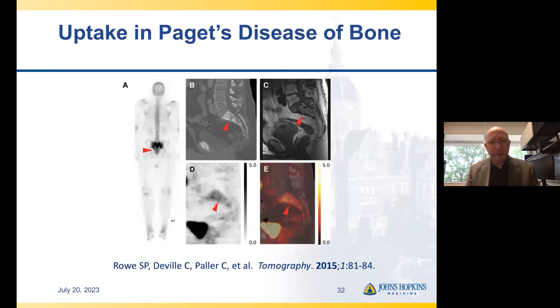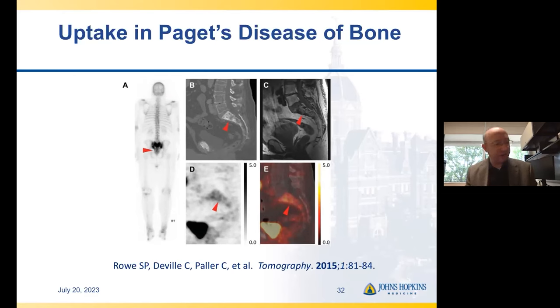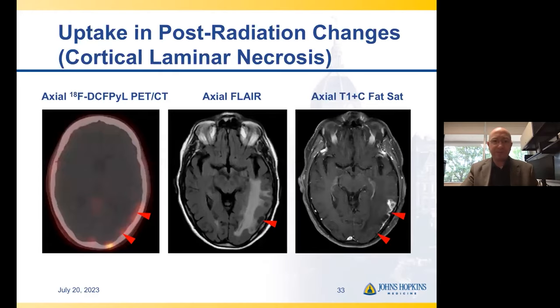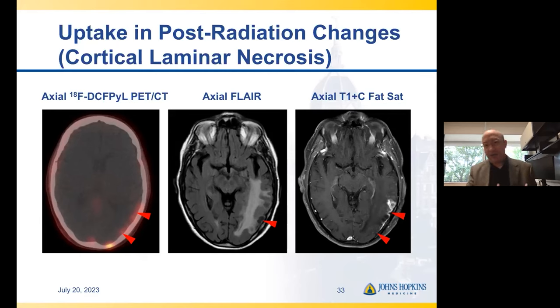The bones are full of hazards for those of us reading these scans. Here's a patient with Paget's disease in the sacrum — uptake throughout the sacrum visible on both PSMA and bone scan, but MRI shows preservation of intramedullary fat, confirming Paget's disease. Inflammatory things can also have uptake — here's a patient with corticolaminar necrosis after brain radiation therapy, with uptake in areas of enhancement on MRI. You'll see this in other parts of the body as well, such as post-radiation changes in the lung following SBRT to a rib lesion, which can show low-level diffuse uptake.